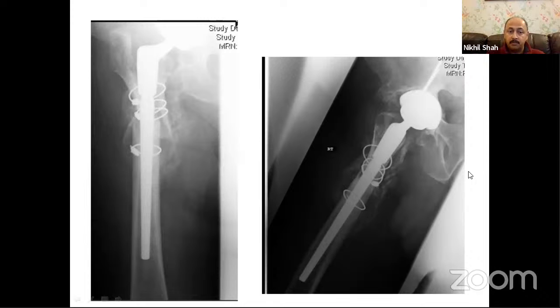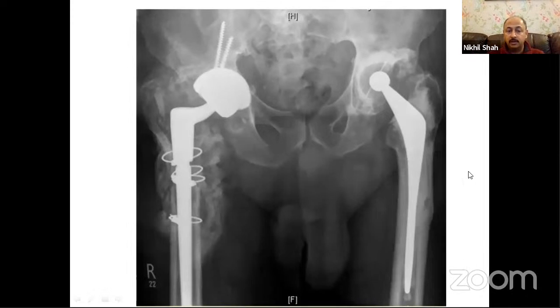You can see that the proximal femur is quite shattered now, quite comminuted, and it has been reconstructed with the help of the wires, but the lesser trochanteric fragment is separate and the greater trochanteric fragment is separate. Nevertheless, he got reasonably good fixation. Post-operatively, within a few months, the patient developed extensive heterotopic ossification. You can see that the hip joint is pretty much ankylosed. And paradoxically, the stem did not ingrow well. So the stem was left loose, but he was functioning because he had a very stiff hip and not very good mobility.